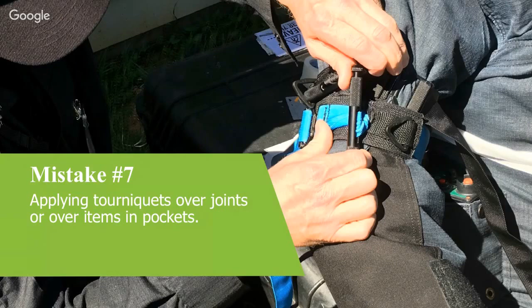A blood pressure cuff is a great way to occlude arterial pressure. When we're taking a blood pressure, that's exactly what we're doing: pumping the cuff up until it occludes the artery, then releasing it and listening for the rush of the systolic, the turbulent flow coming through the artery again. So a BP cuff works as an arterial tourniquet, yes. We always want to apply a second tourniquet above, if possible. If it's too high up and getting into the axilla or the groin, you need to think about converting that into a hemostatic dressing or a junctional tourniquet if you've got access to one.